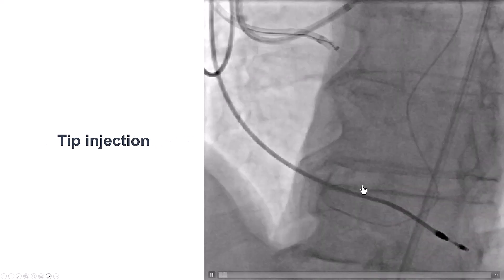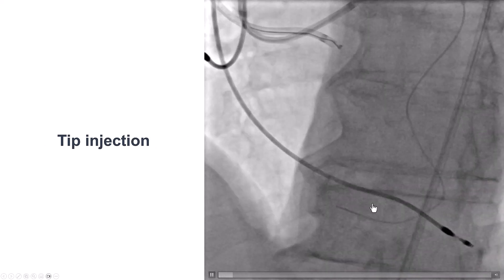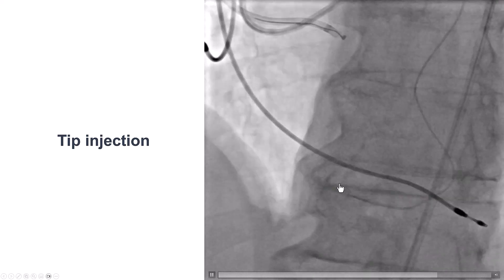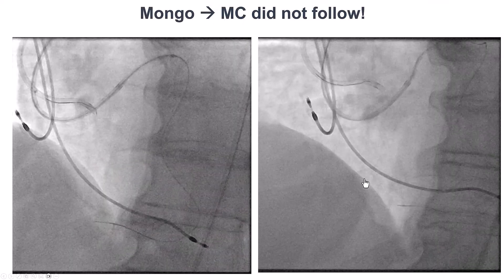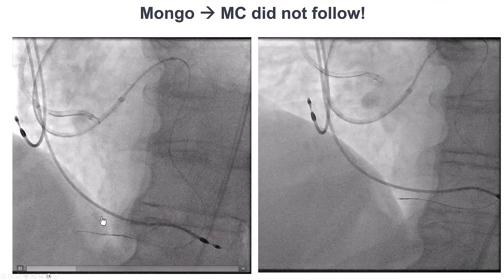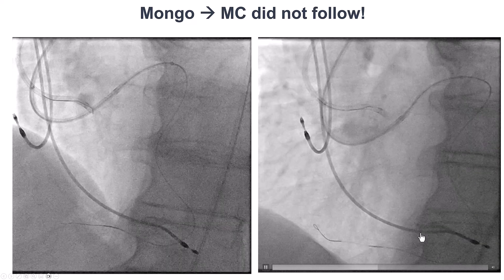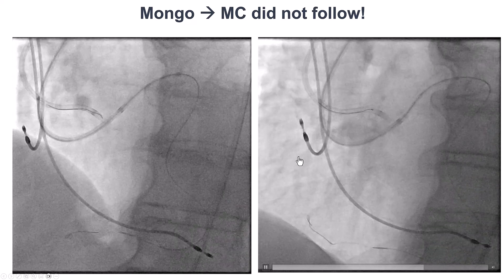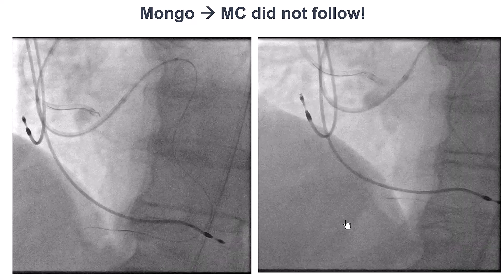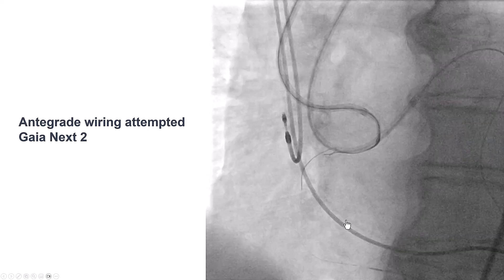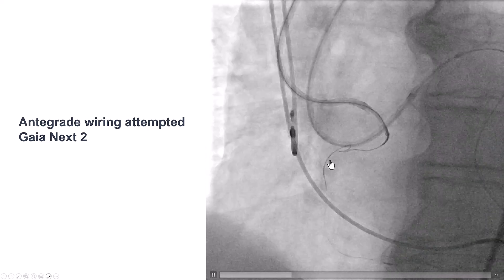We then did a tip injection, which confirmed that we had a blunt distal cap at the bifurcation of the PDA and the right posterior lateral. We used a Gladius Mongo guide wire, were able to penetrate a little bit into the occlusion, and then knuckled the wire — which was beneficial given the long occlusion length. We had difficulty advancing the microcatheter through that area, but were able to get the wire quite close to the proximal cap.